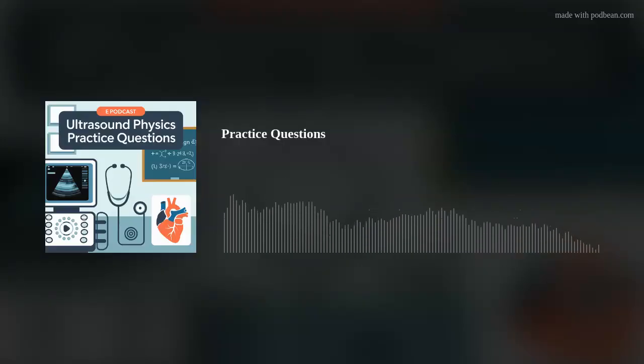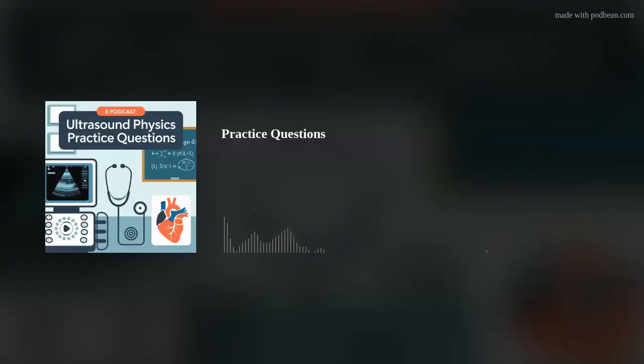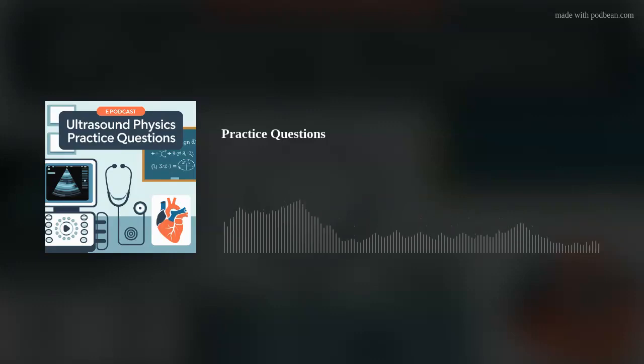What makes a structure hypoechoic? How echogenic something is depends on its acoustic properties, things like density and how it reflects sound waves. A structure might be hypoechoic because it's less dense or because it's made of stuff that absorbs more sound energy. I'm starting to see how all these factors come together to create the final look of that ultrasound image.